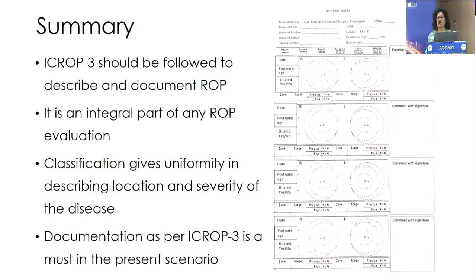subsequently in this course. You will realize that it's very important to document, even whether the pupils are dilated or not dilated, how you have examined, and you have to give the next date. This is the proforma which we follow in our practice.